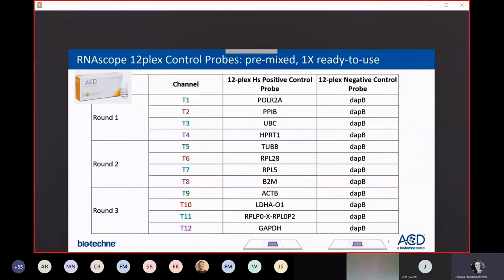The control probes are pre-mixed, ready to use at 1x concentrate. And these control probes, like the other HiPlex reagents, come in these little dropper bottles. So it's really easy to drop these reagents onto your slide. You barely even need a pipette.